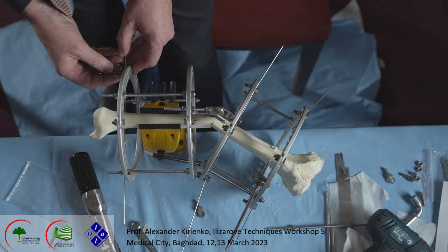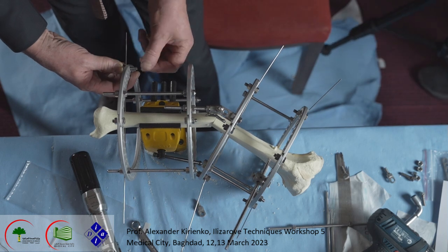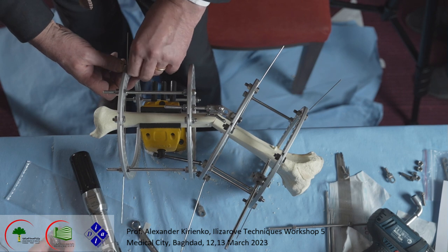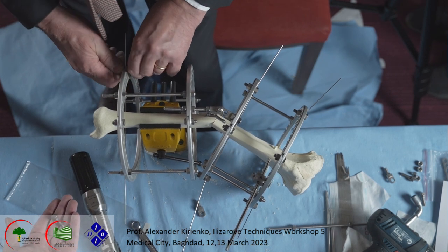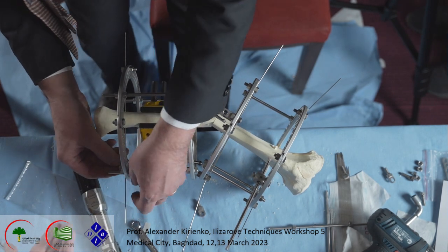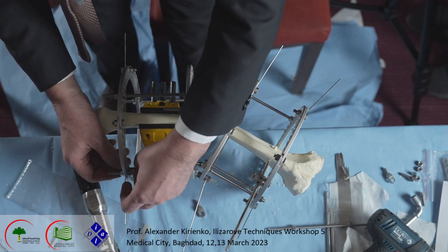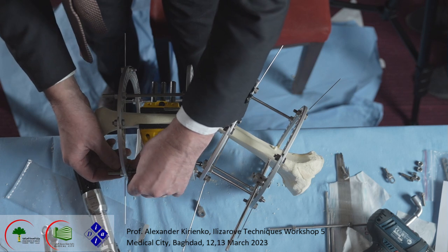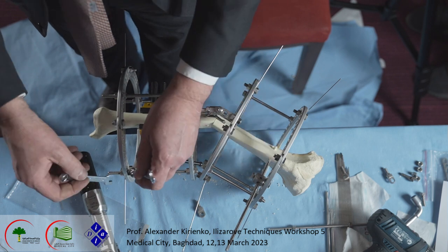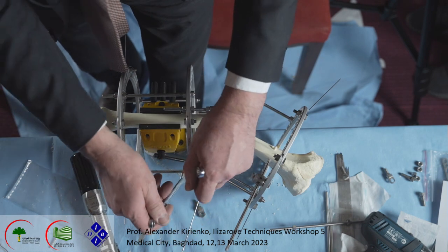One fix it here. Another here. Okay. If this rod's not comfortable, we may change position.